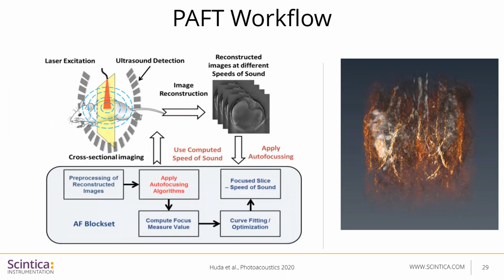Thereafter, these reconstructed images are processed using the autofocusing algorithm, and the focus measures are employed to determine the best matching speed of sound. Based on this algorithm and the computed speed of sound, the 3-dimensional image is reconstructed.